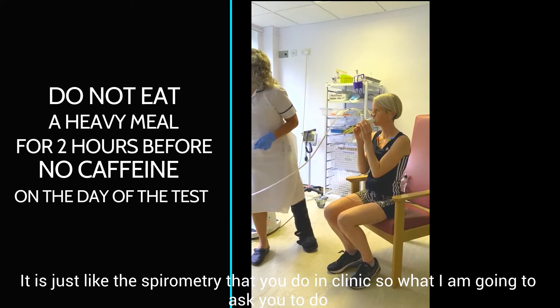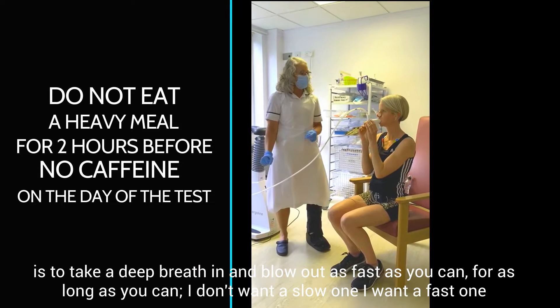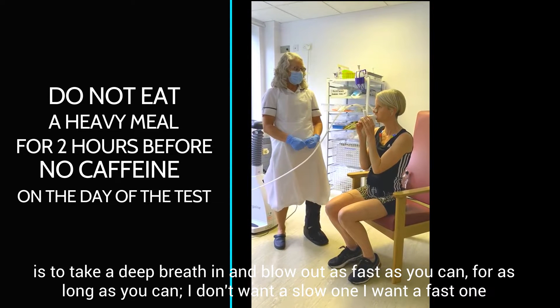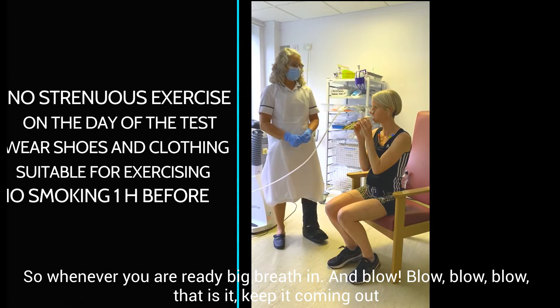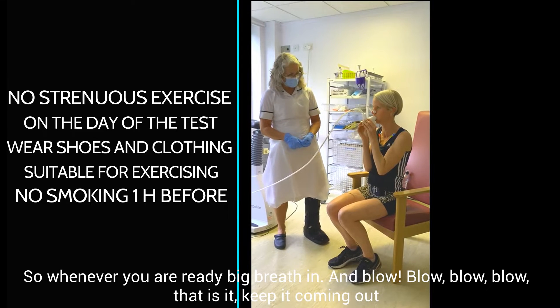It's just like the spirometry that you do in clinic. So what I'm going to ask you to do is take a really big breath in and then blow out as fast as you can and for as long as you can. I don't want a slow one. So whenever you're ready — big breath in. And blow, blow, blow, blow.